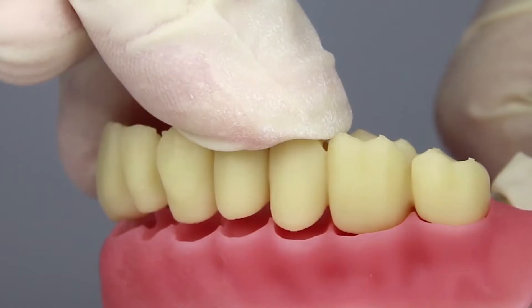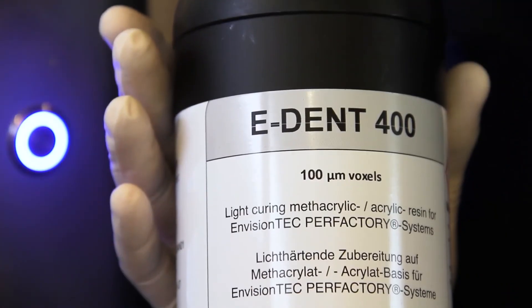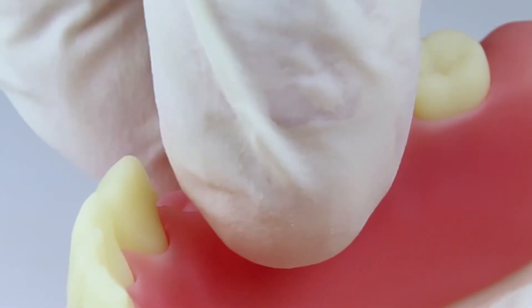EnvisionTEC recently released the e-denture base material. It's the first FDA approved denture base 3D printing material, and it can work with the E-Dent 400 to make a full digital denture process.